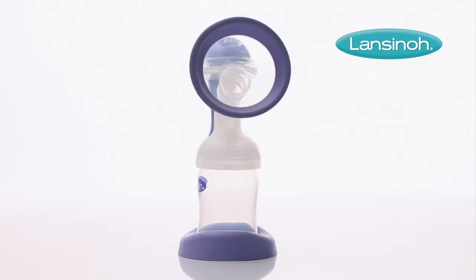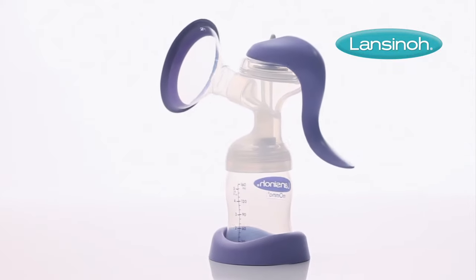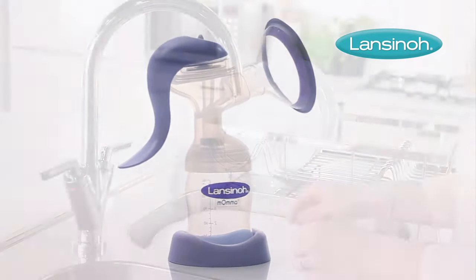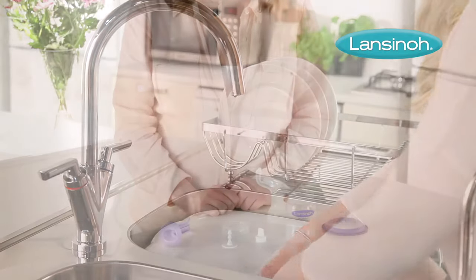It's quick and easy to put together Lansinoh's Manual Breast Pump, a portable and convenient option for occasional breast pumping or on the go. Remember to always wash your hands thoroughly with soap and water before handling any of the pump's parts.